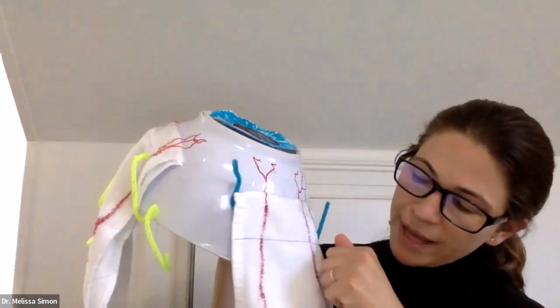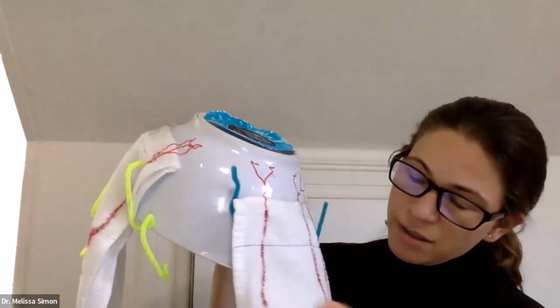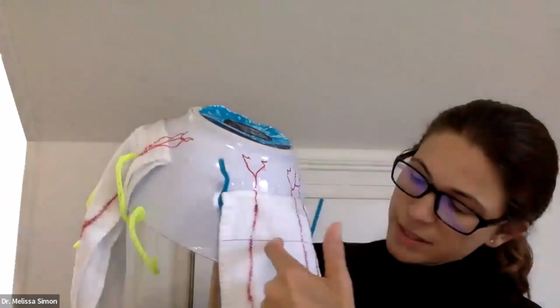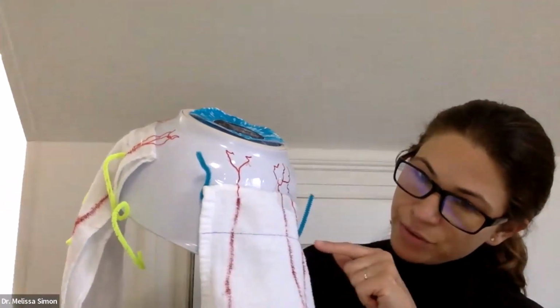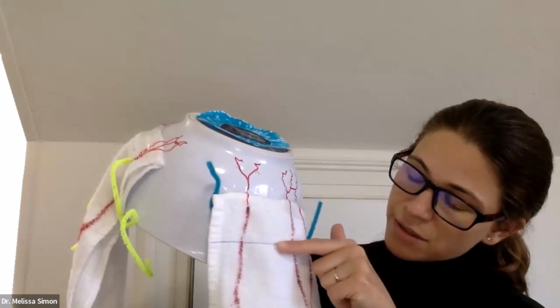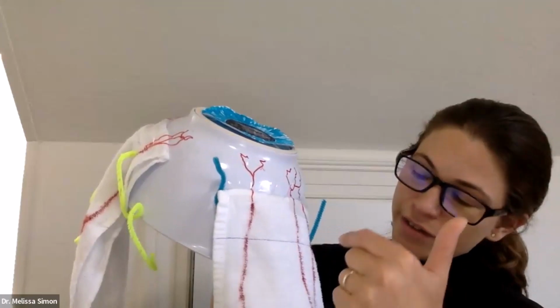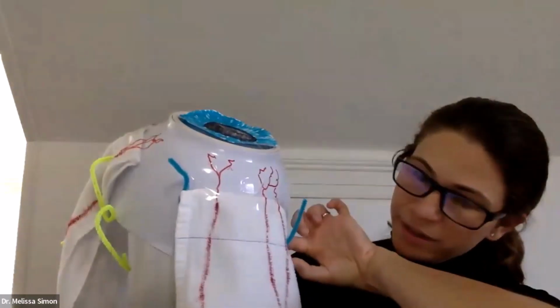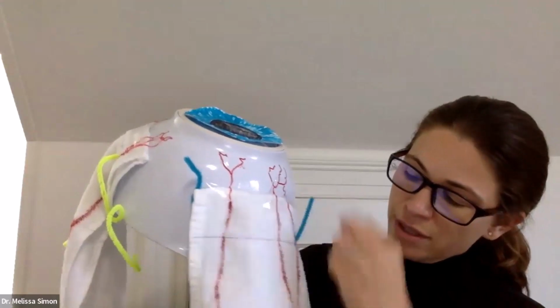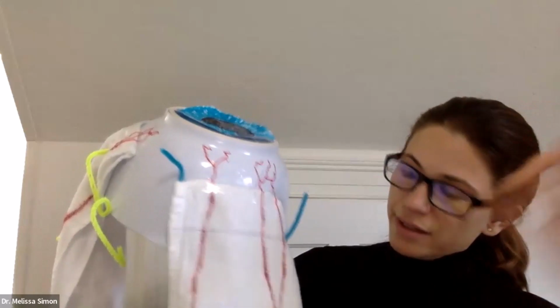And you just kind of pull back on your suture and then pull forward so you don't get an air knot. Then you go in the other direction, partial thickness, center to edge, back through the same hole, very superficial, just underneath the vessels, edge to center hole, and then your full thickness. You leave a little loop here like this, and then you do full thickness through your original hole, down below, and you pull it through the loop to lock it.